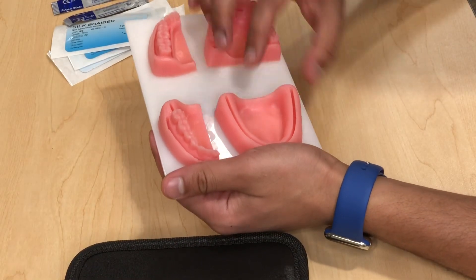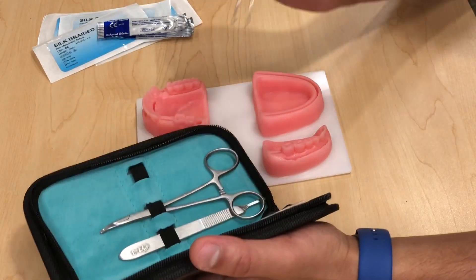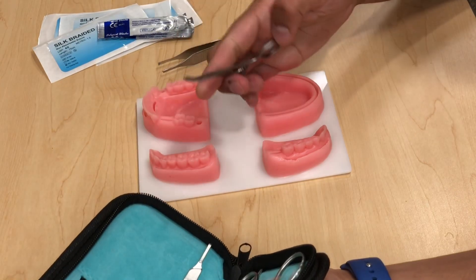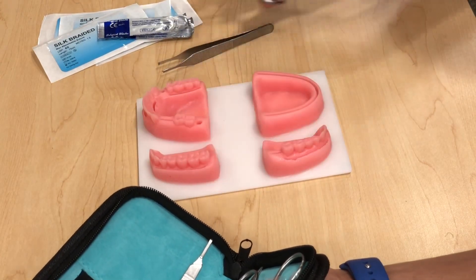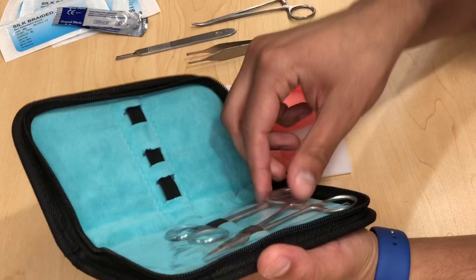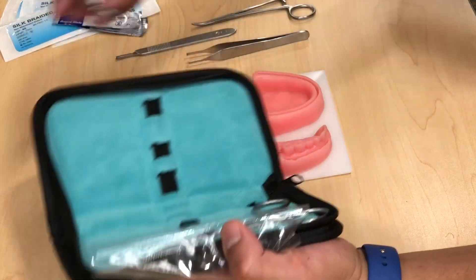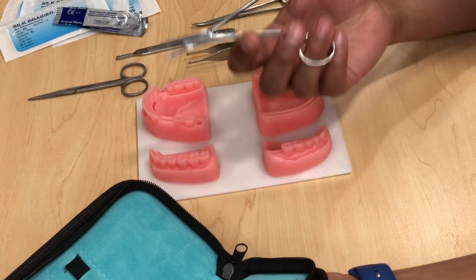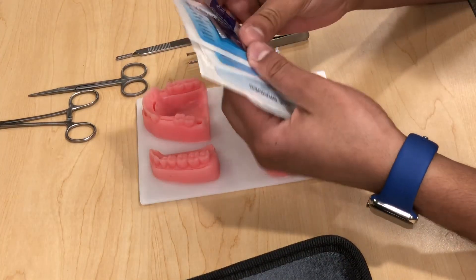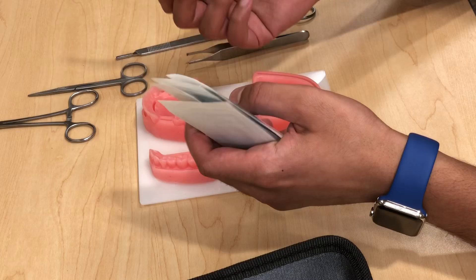We've got our oral cavity model here — it has some sockets, extraction sockets, and big flaps. We have our kit over here with all the instruments you need: Addison's tissue forceps with teeth, a hemostat, a blade holder, scissors, a needle holder, suturing material, and some blades if you want to make your own cuts.